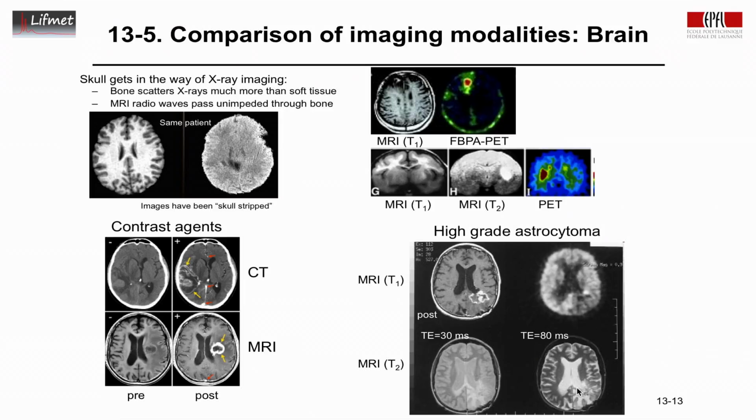A longer T2, in a T2 weighted image, bright means longer T2. A longer T2 means disruption of cellular membranes, of proteins and so on. There's less of that, and more of the fluid content of the brain has increased. This is a hallmark of tumors, but it's also a hallmark of edema, so these two cannot be distinguished.